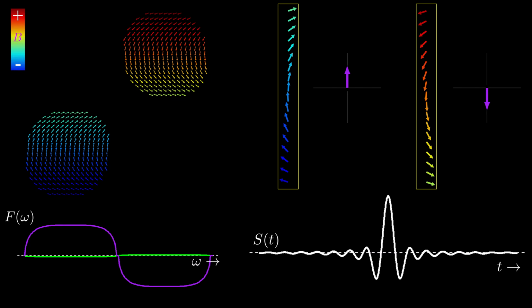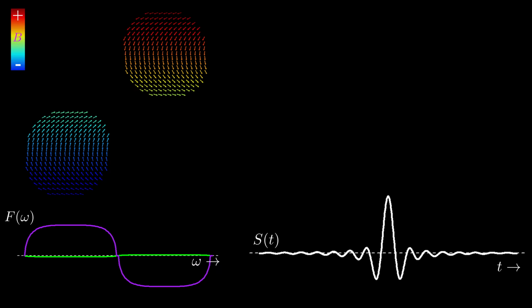So here's the take-home: by winding up spins perpendicular to the frequency encoding direction, the phase change we induce reflects the overall spin locations in the perpendicular dimension. This step is called phase encoding. Now, it probably doesn't make perfect sense just yet, but let's continue with the math just like we did with frequency encoding and see what we learn.